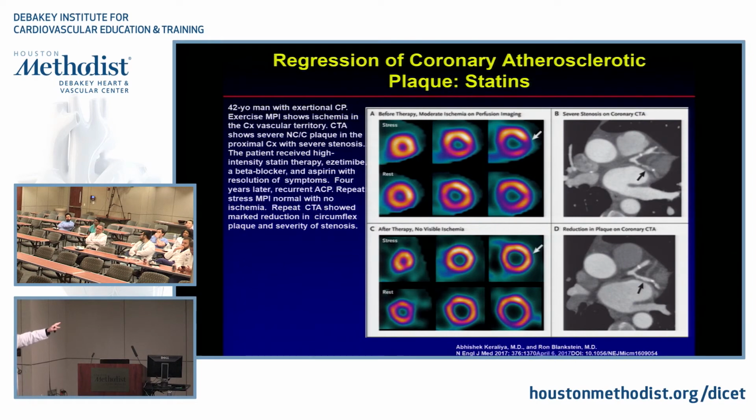So we're actually talking to Siemens about this because I think there are some very interesting ways we can improve our reliability of being able to look at plaque categorically by actually doing normalization of contrast, which is something we don't do on CTs routinely, right?